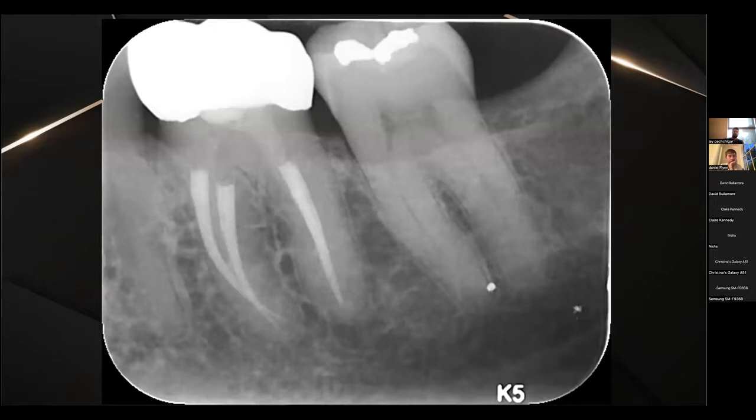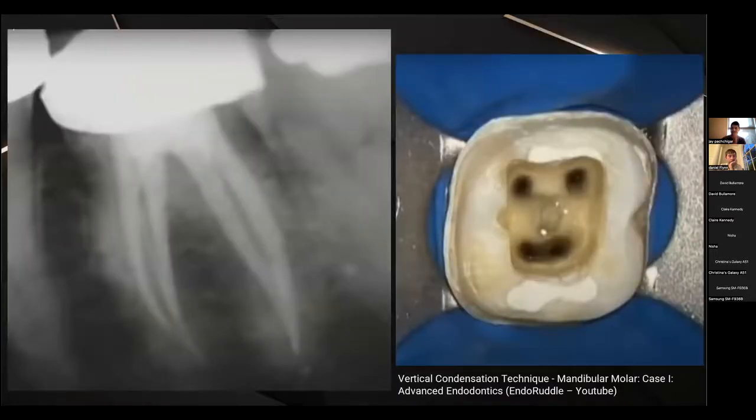But there's just another one. This was a video I was looking at on YouTube, and this was actually done by Cliff Ruddle. And again, I think he's gone up to an F3 as well. And you'll see, particularly on the distals, it's quite a large prep. But again, it's a fantastic root canal, nothing really wrong with it. But again, the access is taken off quite a lot. Mine looks like a piece of shit compared to this, and I'll probably spend 6 times longer on it.